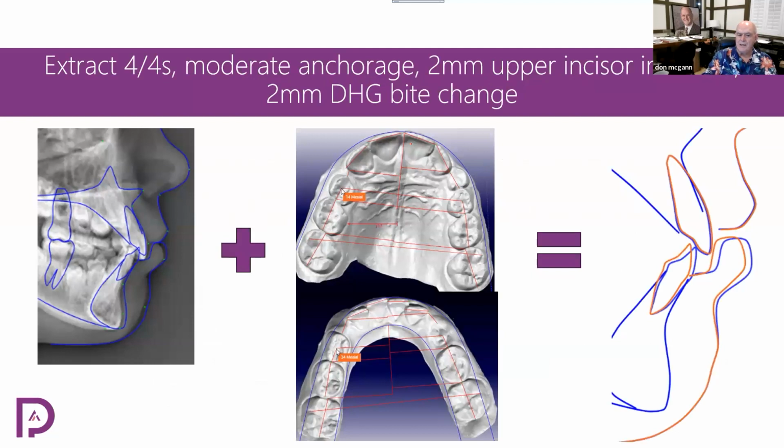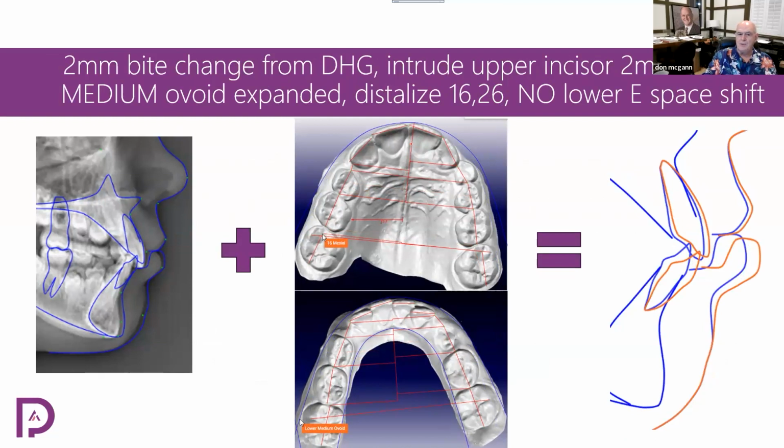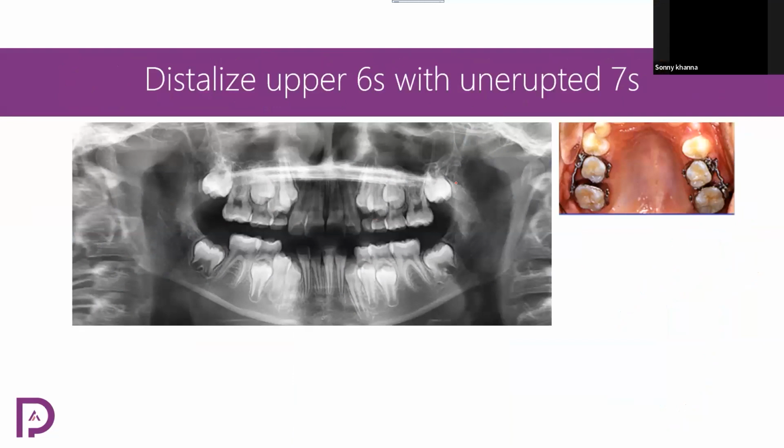So we'll do a phase 1. This one is extract upper and lower fours to get rid of the protrusion. This one has a 2 millimeter bite change from differential horizontal growth, intrude upper incisor 2 millimeters, medium ovoid expanded from small ovoid, distalize 1626, and no lower E space shift. Okay, so here's the distalization in the model measuring. Right there. You wouldn't want too much more than that, especially without molar rotation. And then we have the growth, and that's correcting. Hopefully it's all going to end up in the right place.